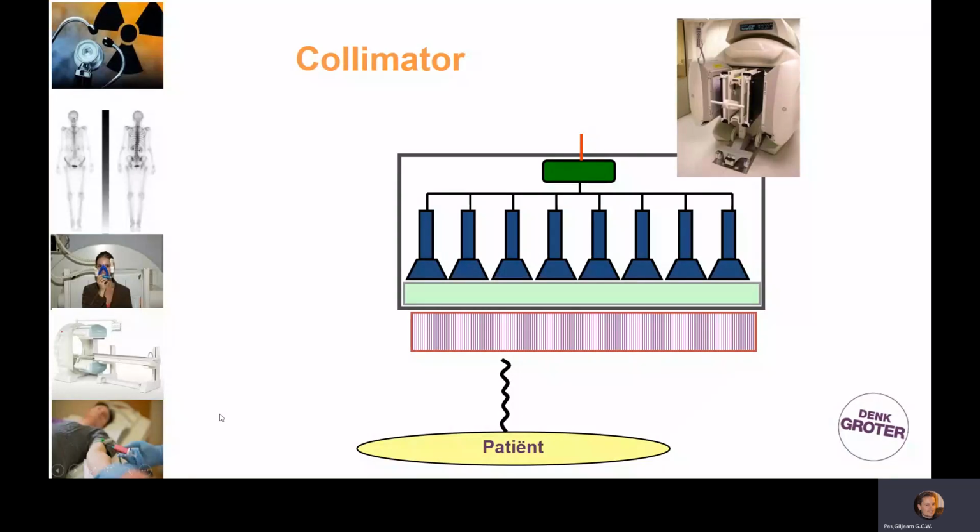Hello and welcome to this knowledge clip in which I will discuss with you a certain part of our gamma camera detector, and that is the collimator.